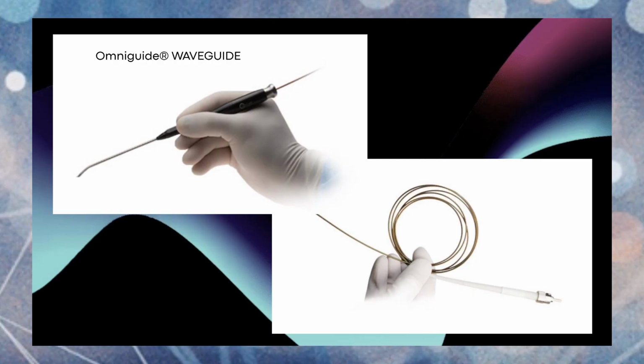However, because it's not completely straight, there is some dissipation of energy. And with that dissipation of energy from the angles that are made, there's heat. So these systems have been optimized to control the heat, but there is still heat. And so what happens is you get a loss of the input energy to the output, and you lose even more energy the more curvature you have.